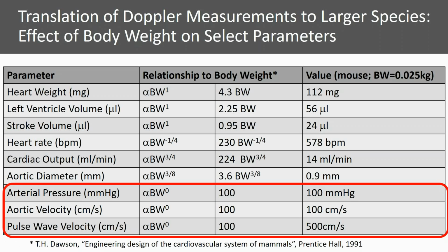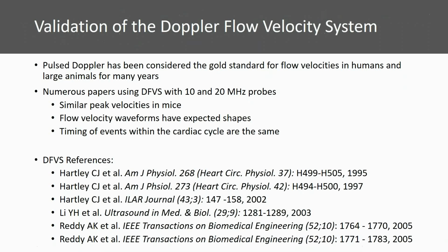Of course, arterial pressure is an invasive measurement, but we are talking about aortic velocity, which is a non-invasive measurement, and pulse wave velocity is also a non-invasive measurement. So I'll talk a little bit on the next slide about the history of the application.